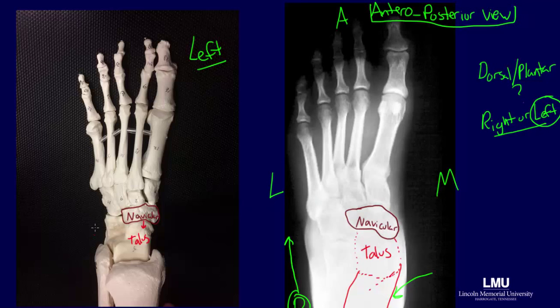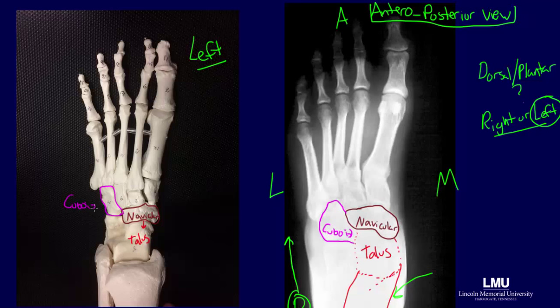Lateral to the navicular is the cuboid bone, which articulates posteriorly with the calcaneus. Here, the cuboid is being highlighted in a magenta color on both the radiograph and the model. We know that the bone directly behind the cuboid is the calcaneus. So again, the cuboid articulates with the calcaneus, and the navicular articulates with the talus.